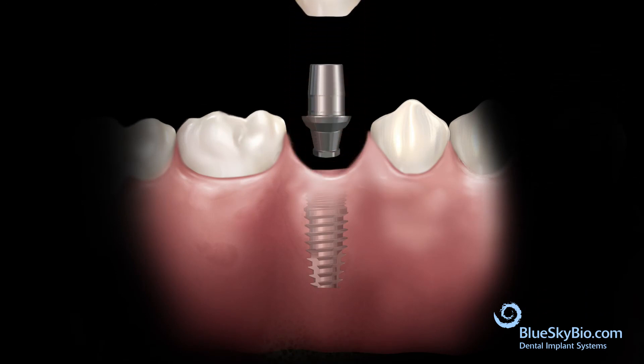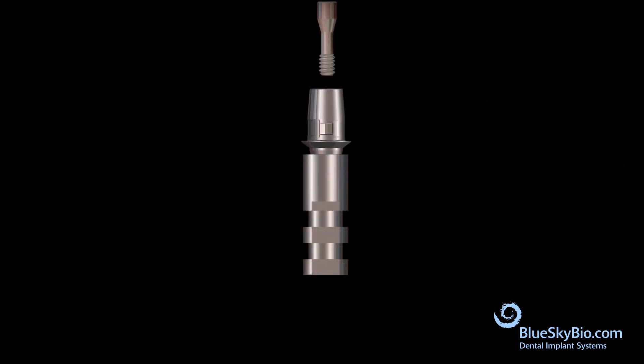Remove the crown and the abutment. Insert the titanium angled base abutment into an implant analog and secure with light pressure. The wood end of a cotton tip applicator is inserted into the abutment screw channel to keep it protected.